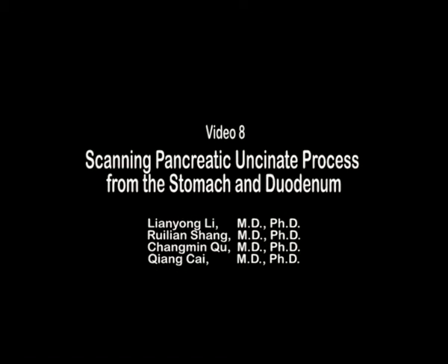Video 8. Scanning pancreatic uncinate process from the stomach and duodenum. This video provided an introduction to scanning the pancreatic uncinate process from the position of stomach and the second part of the duodenum. The landmarks to look for are the mesenteric vessels, the aorta, and the inferior vena cava.